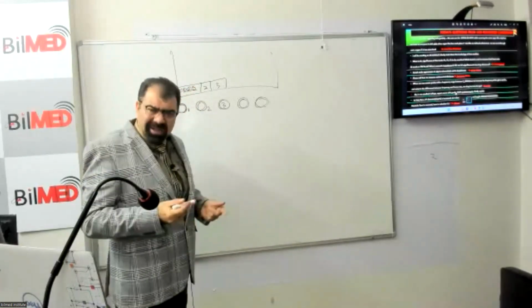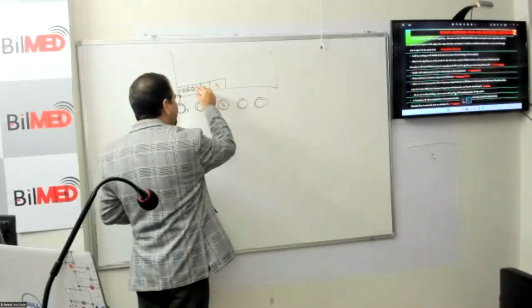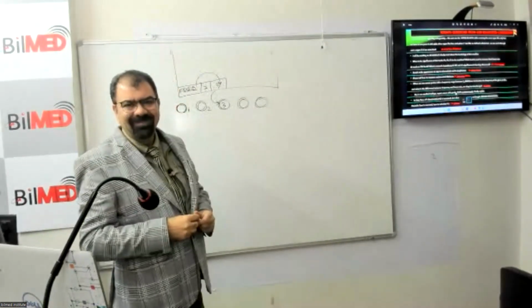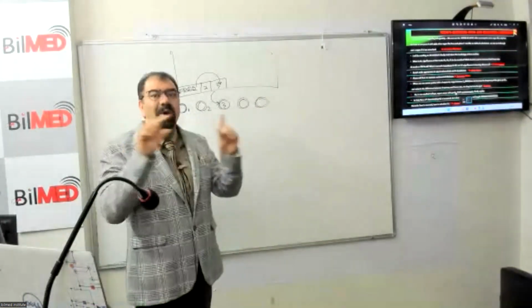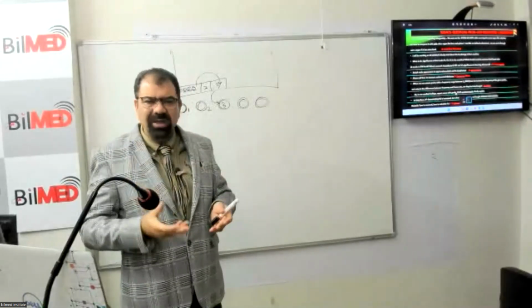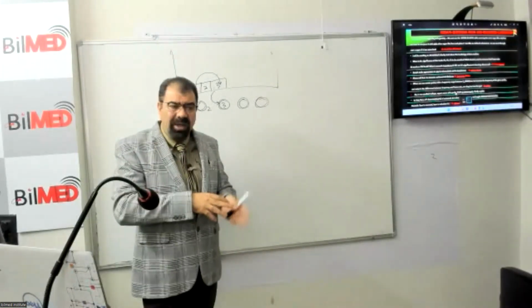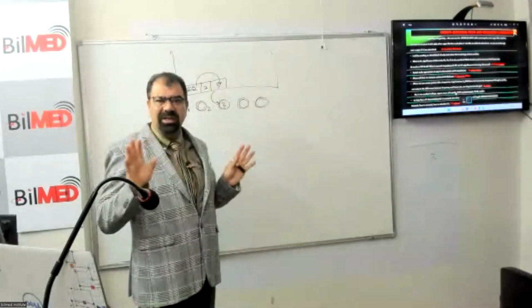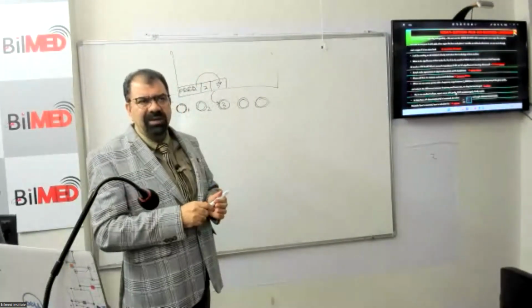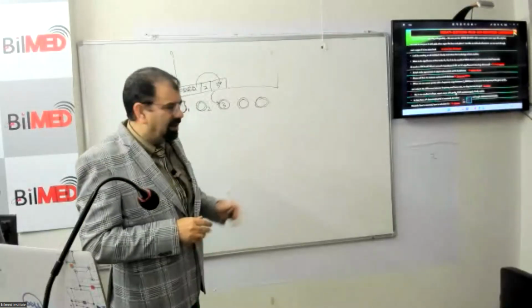But what if the machine is not showing the frequency in the first box, but in the third box, for example? Then the third box will be for the frequency. So you have to see on the monitor. The monitor is always showing you, but you are not knowing it. That is why you are posing this question. For that, we have taken a class over there. We have shown you on the machine. Right now, I am not taking a course on how the machine works. Please go to the physics and machine settings course. There is a class of knobology. These things are covered in great detail over there.